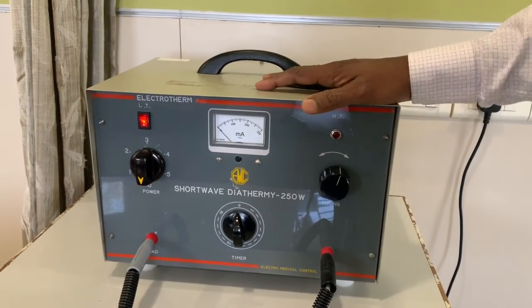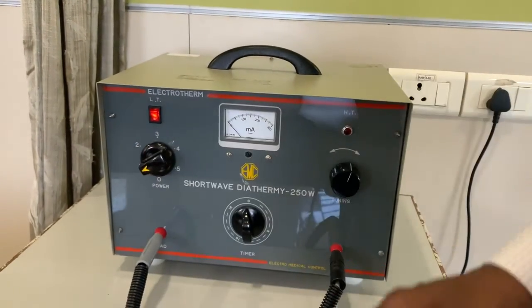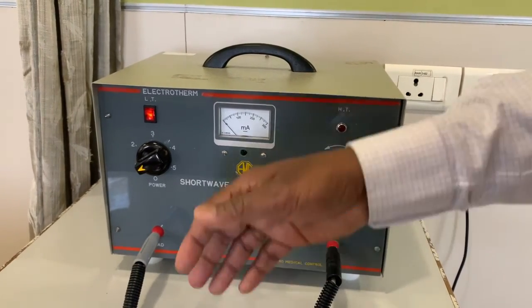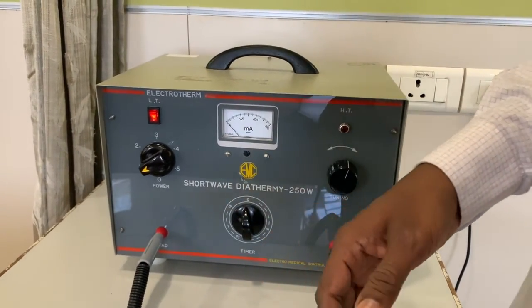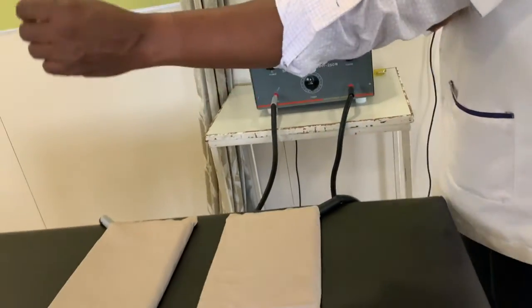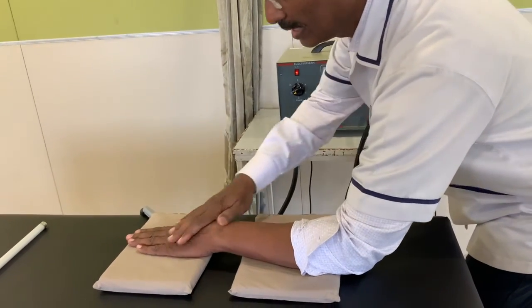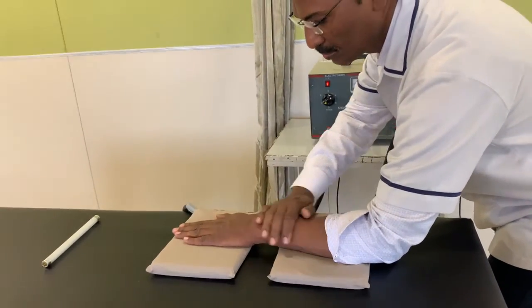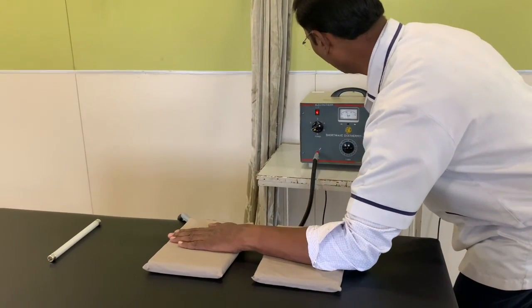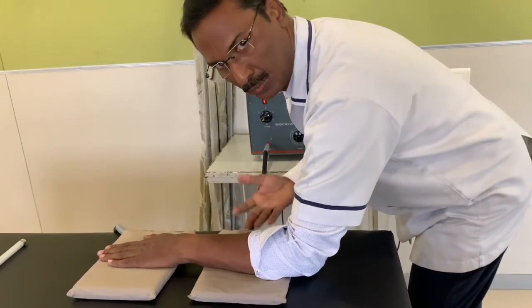So next step is the power. You increase the power to level 1, and finally the timer. Before you increase the timer, you place the hand to be tested. You place your hand on both the electrodes. You will see that the hand is placed properly and the contact is proper on both the electrodes. Then you increase the timer, and I can see some amount of warmth.